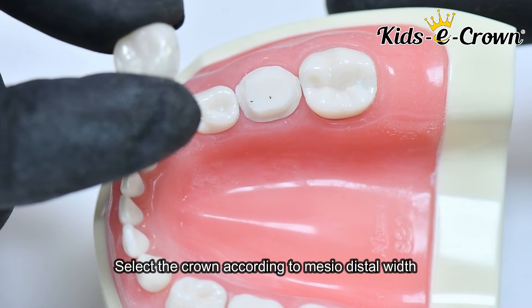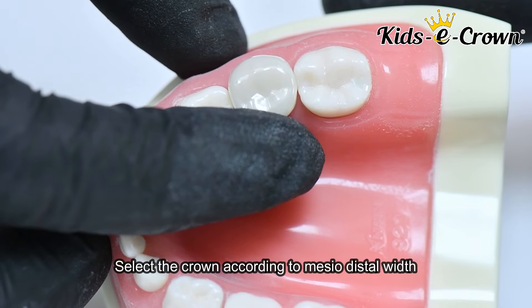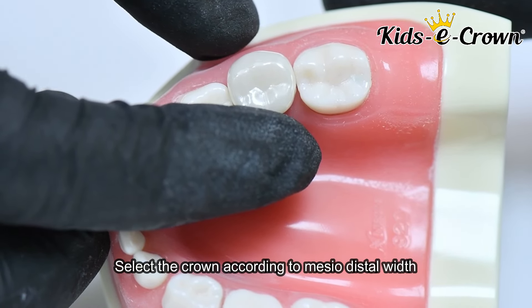The next step is to select the crown mesiodistally. You will not contaminate the crown, and you will select the right size of the crown mesiodistally.